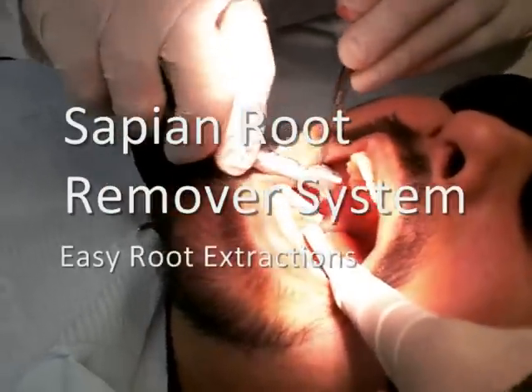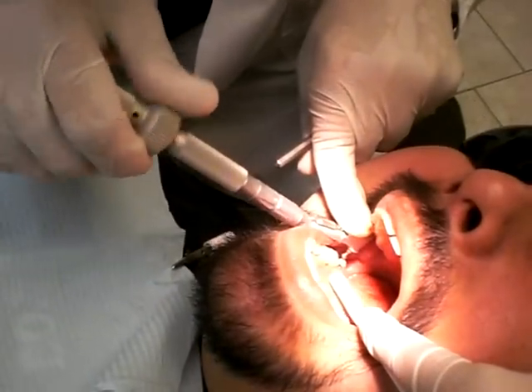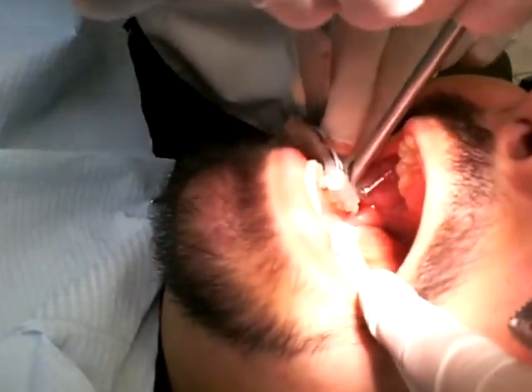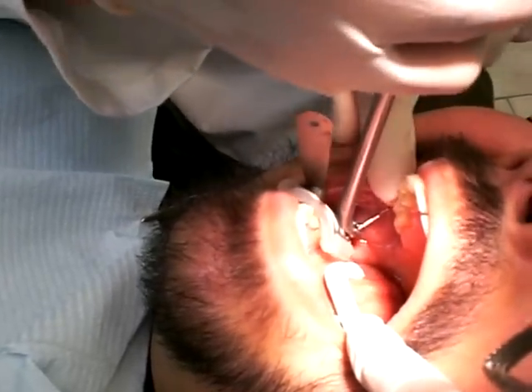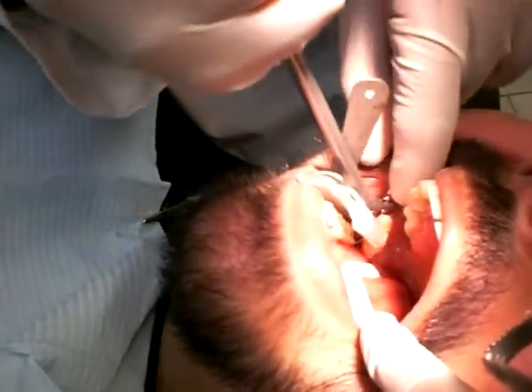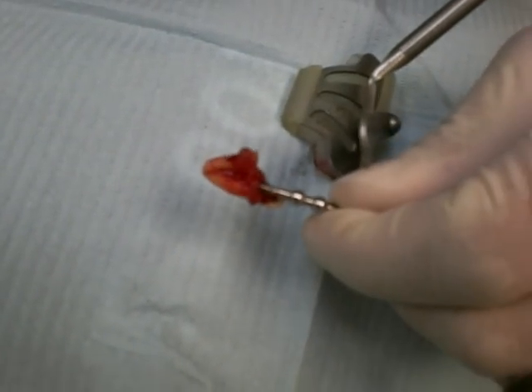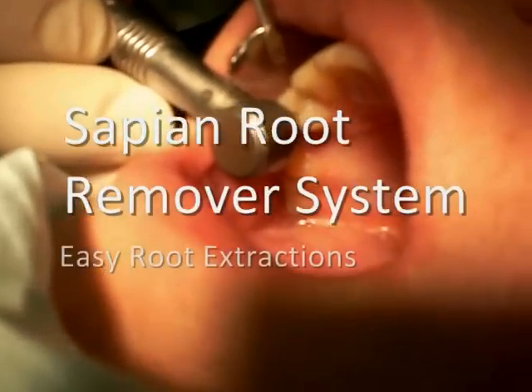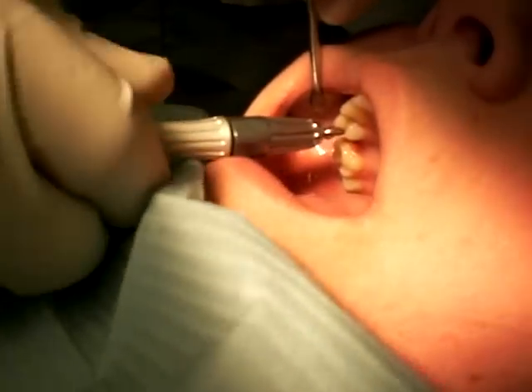I think he's got pus in there — I think he's got an infection. Open. Done deal, dude. Look at that. Sweet.